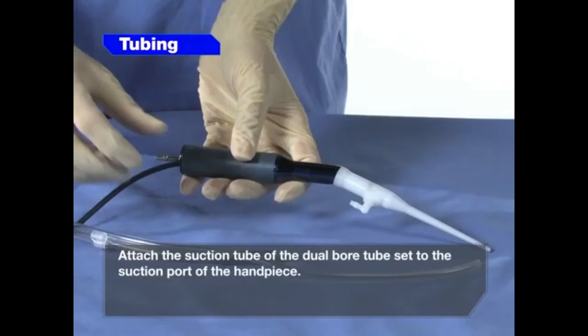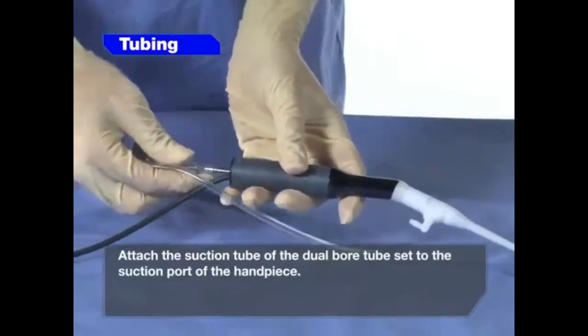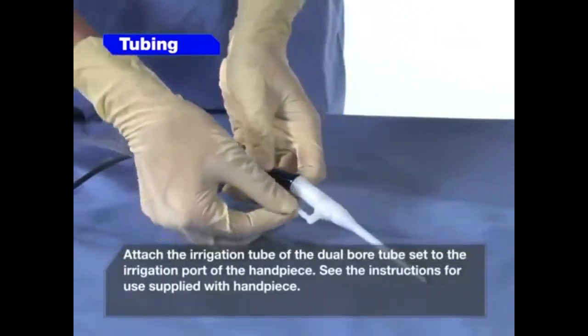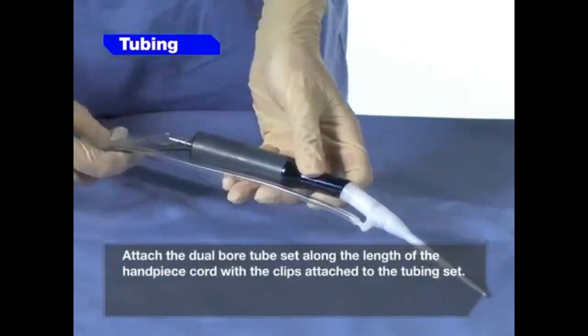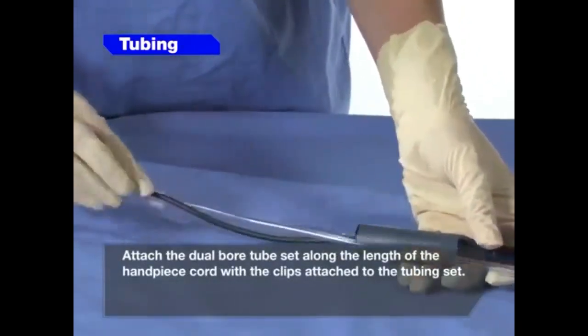Attach the suction tube of the dual bore tube set to the suction port of the handpiece. Attach the irrigation tube of the dual bore tube set to the irrigation port of the handpiece. See the instructions for use supplied with the handpiece. Attach the dual bore tube set along the length of the handpiece cord with the clips attached to the tubing set.